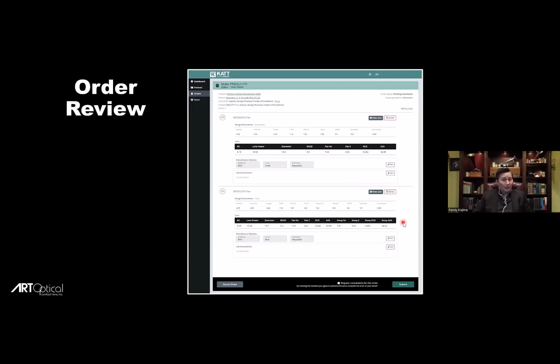Now, when it's all said and done, you can send the order directly to Art Optical. You can click this little box here to request consultation. If this is the first time that you've done an Ortho-K patient and you want Bethany and the consultation team to just have a second set of eyes on it to make sure you've done it right, you can just click that box. It goes straight to the consultant. If that box is unchecked and you click submit, it's going to go to customer service. They're going to process the order and send it to you.